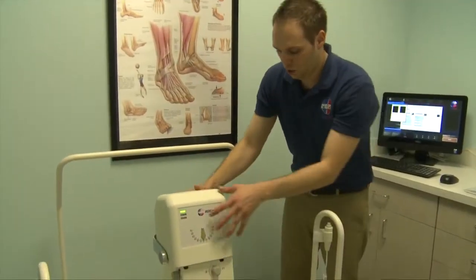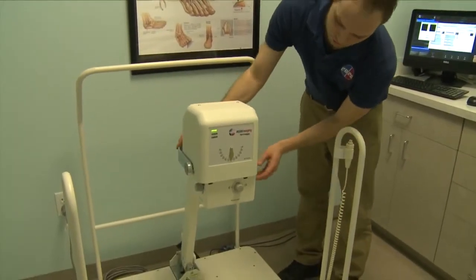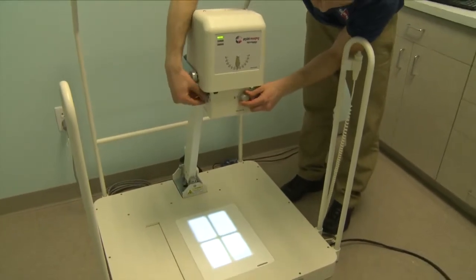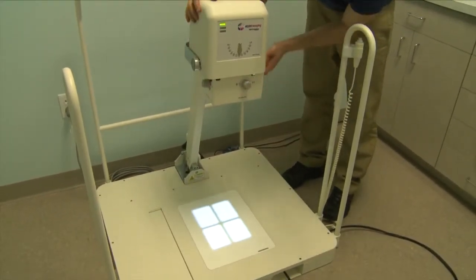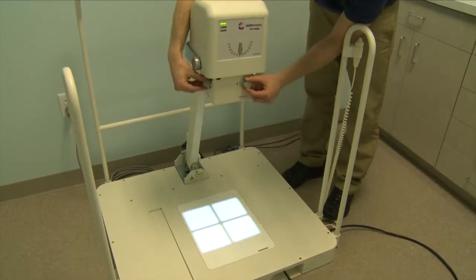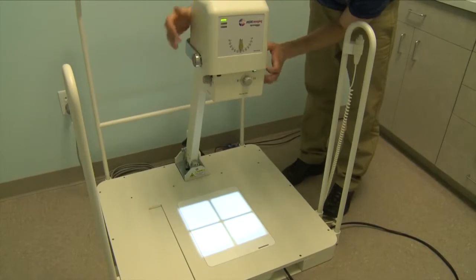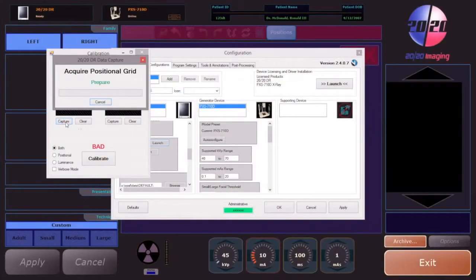Position the tube head straight above to be seated at zero degrees. Line up the collimators so it is centered directly above the panel. Once you have it centered, simply open the collimator light up as far as it goes. Back at the computer, we're going to prepare the shot by clicking the capture button for positional grid.